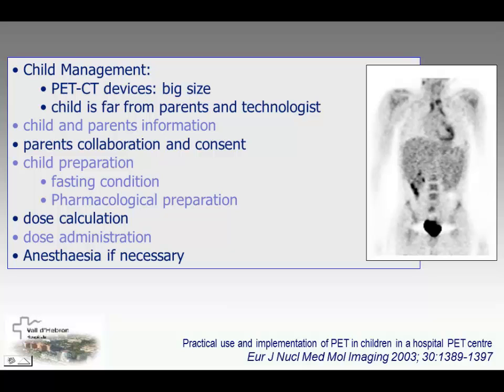The child has to come to our service in fasting conditions, and very often we have to give them pharmacological preparation. We have to calculate the dose very adequately, as detailed before. The dose administration is also very important.